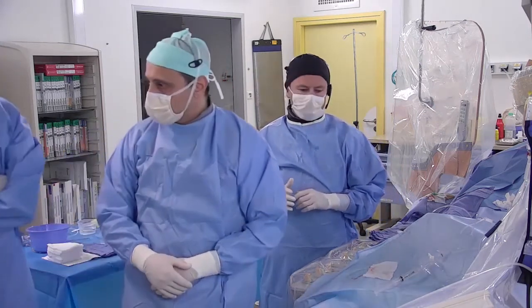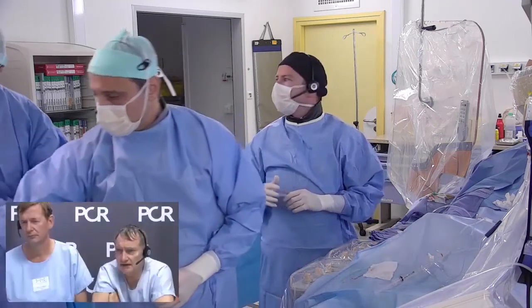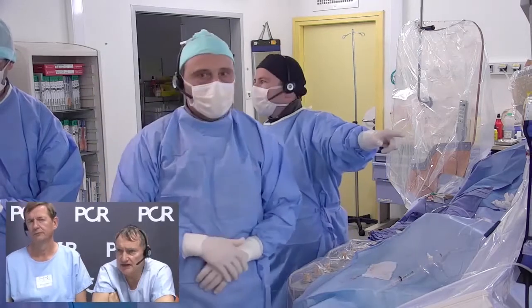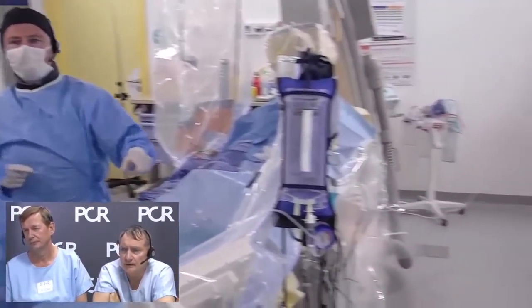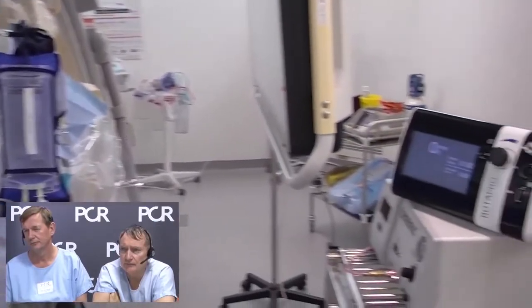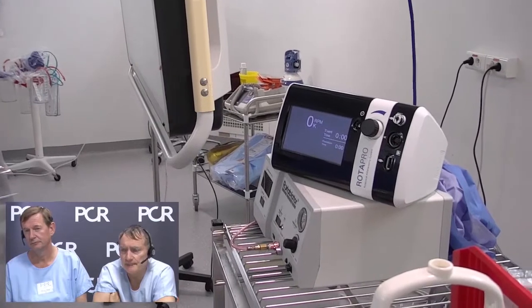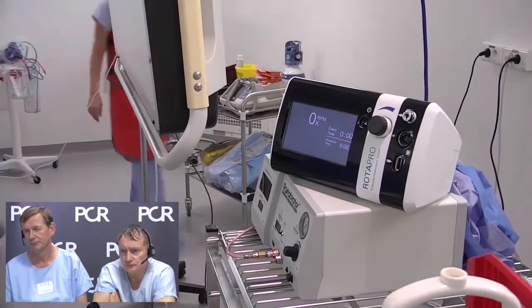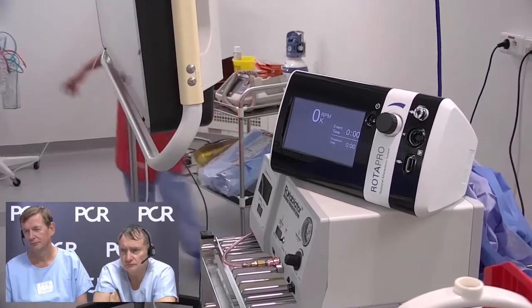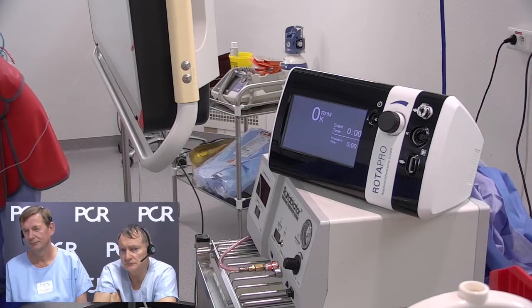Could you show the old console of rotablator and the new one to explain the differences between both? Yes, give us a second, Didier. We will just turn the camera towards the console. You have the two of them: the old one below, the dinosaur, the previous version, and the new one above, which is much more catchy. The first rotablator was done 30 years ago.